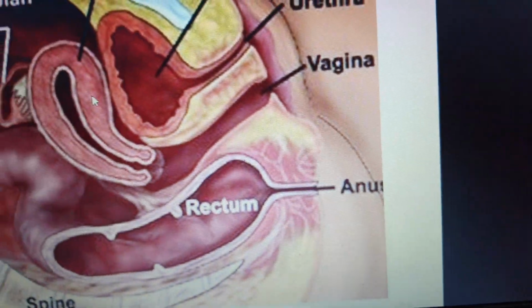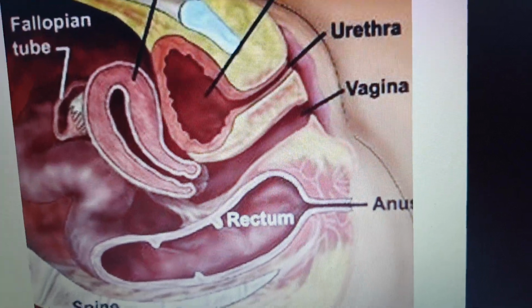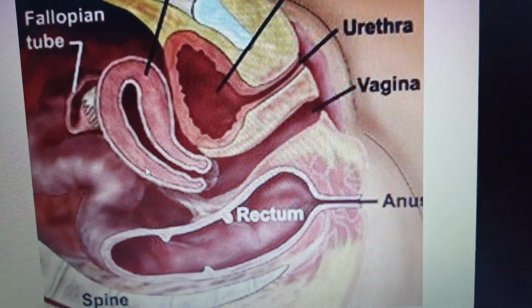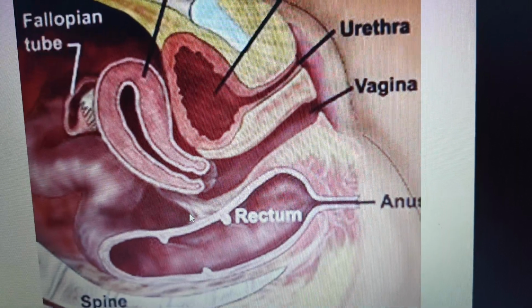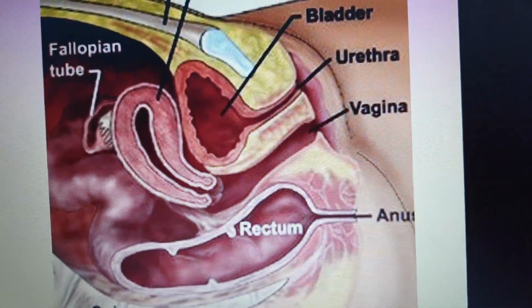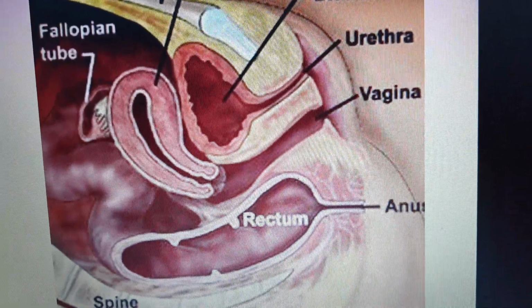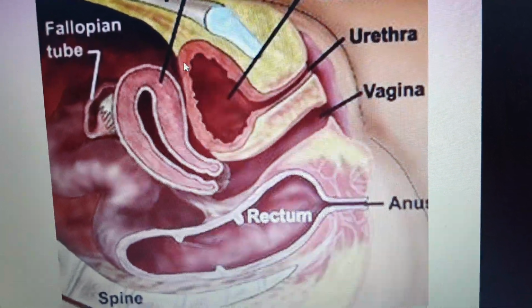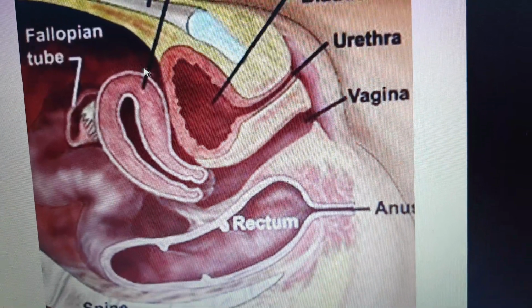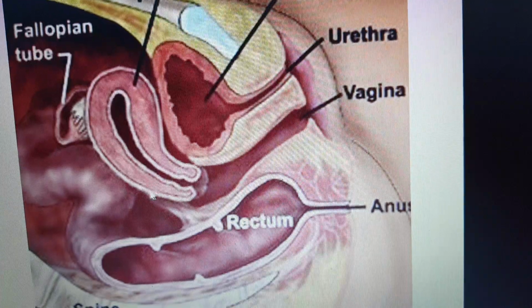And of course, that corresponds to the anatomical position. This is the normal sagittal view we know by anatomy: the urinary bladder, the uterus, and the rectum. And so accordingly, you can know that these findings are very easy to see. And of course, we should remember that there is a peritoneal reflection here, the uterovesical pouch, and again there is another peritoneal reflection here, which is the Douglas pouch.